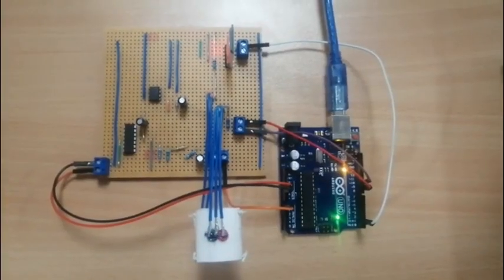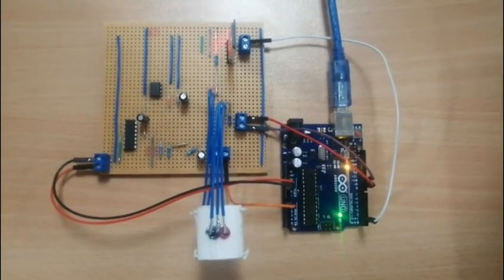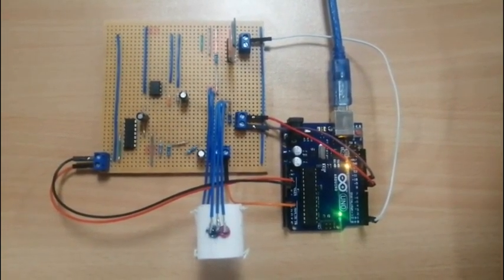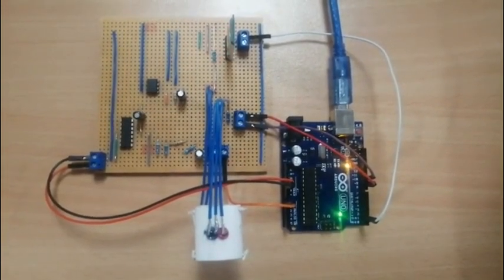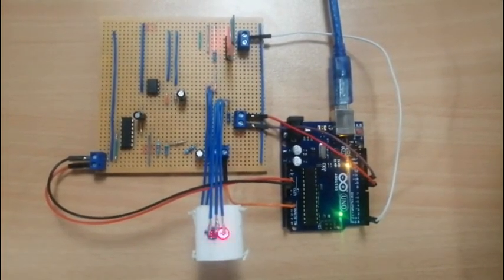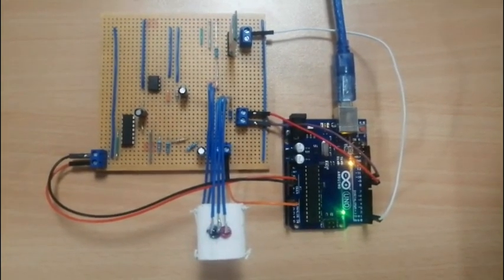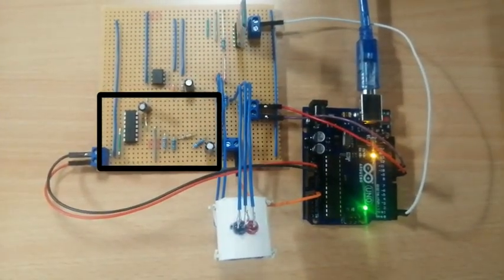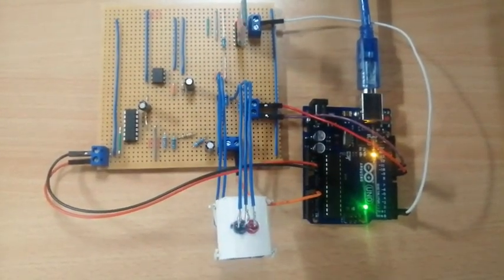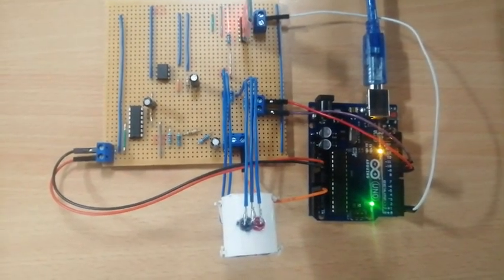So the output from the photodiode is a really small current corresponding to the amount of light detected. The output current is fed to a transimpedance circuit which converts the current to a voltage and amplifies the voltage. The amplified voltage goes through the filter, which is the next stage. The bandpass filter filters out frequencies below 0.8 Hz and greater than 5 Hz and further amplifies the voltage signal.